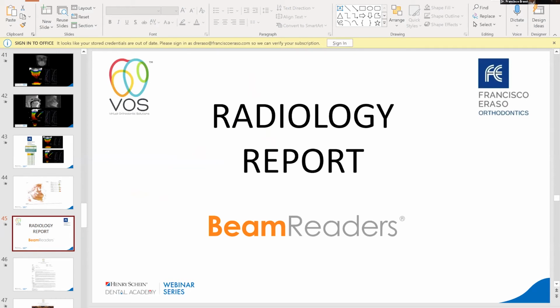Okay, then you have to go to TMJs. You go from one side to another. Here, as you see the TMJ, you're going to describe the findings here and here. Okay, very quick. I'm sorry, I'm giving you a quick tour of radiology reports. Then in my gallery, I have very useful information as far as panoramics, as far as models.